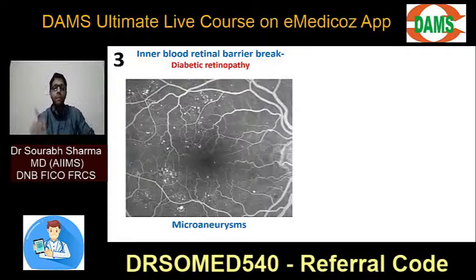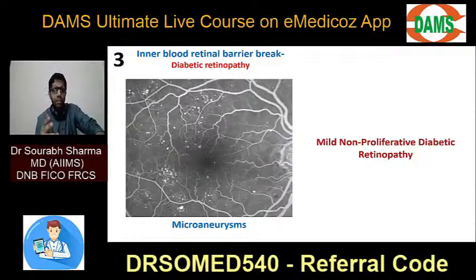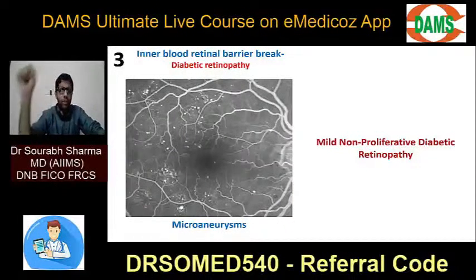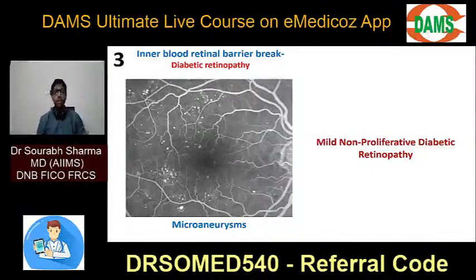These are known as microaneurysms. Very early stages, mild non-proliferative diabetic retinopathy, dots seen everywhere in the retina. That is another clinical application.